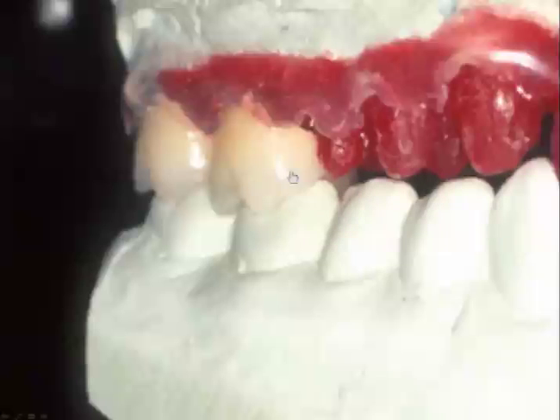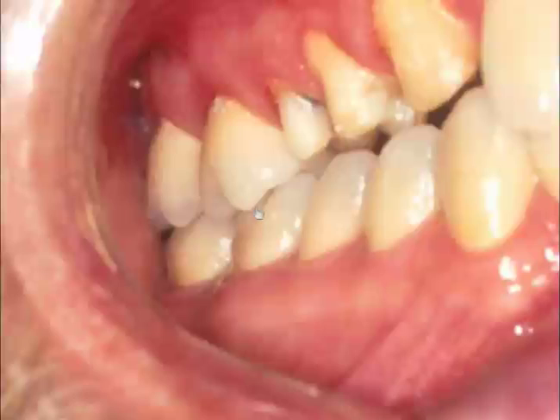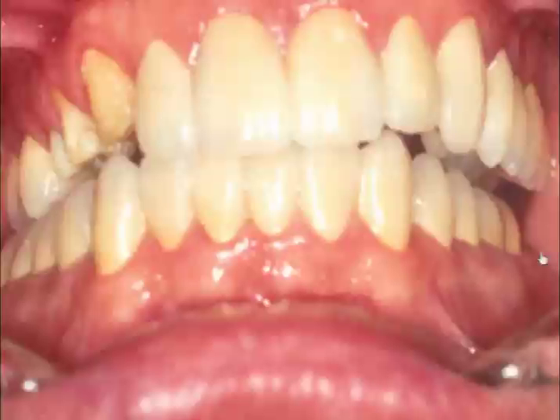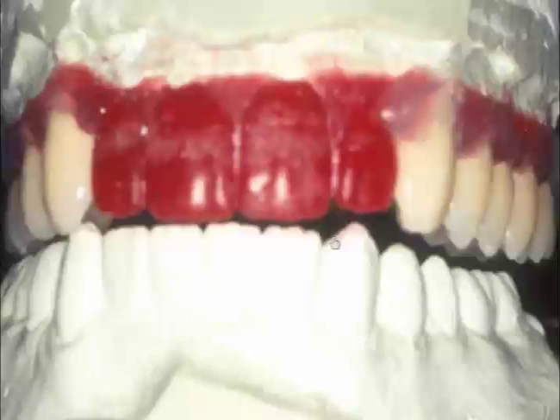So here we can see how the restoration fits on the articulator, and then we can see that it fits accurately in the mouth. Then we can see how that 6-year molar functions on the articulator with no canine guidance, getting disclusion of the non-working side. We can see how that works also in the mouth. Then when we get to canine guidance, we get excellent disclusion of all the teeth and no interferences back into occlusion. In other words, if this patient was to wear or break this canine, the first bicuspid will start picking up guidance with no interferences of the teeth.